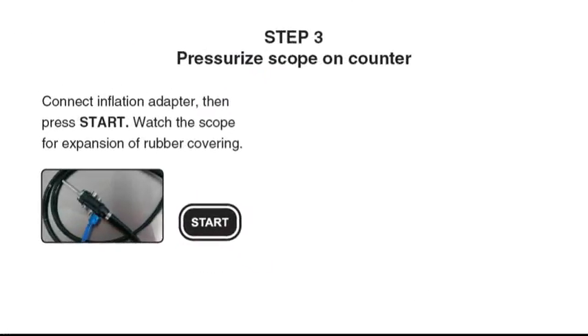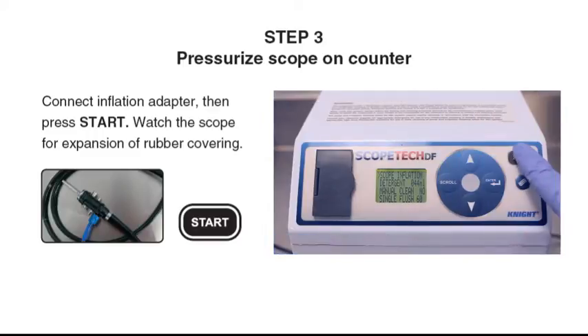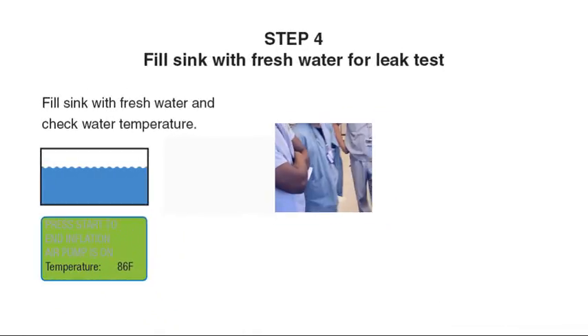Step 3: Connect the inflation adapter, then press Start to pressurize the scope on the counter. Watch the scope for expansion of the rubber covering. If the scope cannot maintain pressure, follow the scope manufacturer's instructions for further processing.